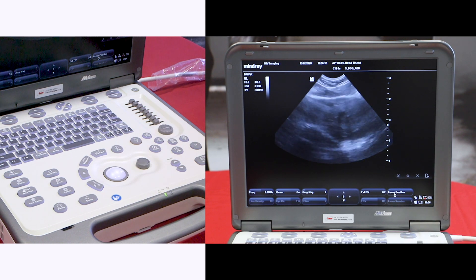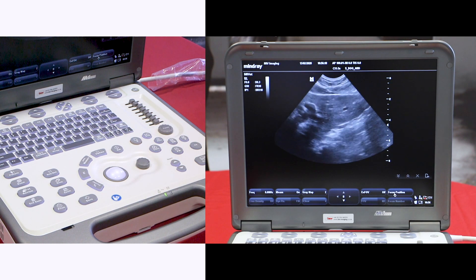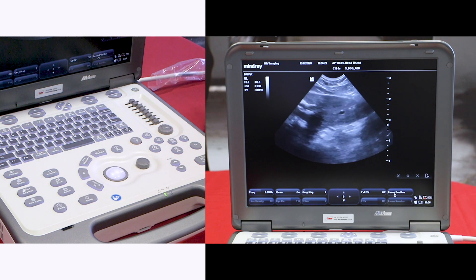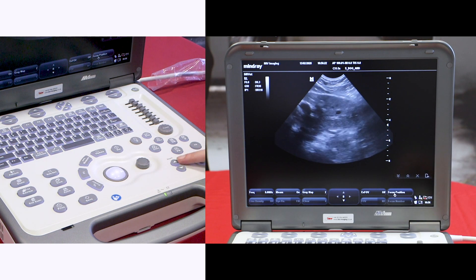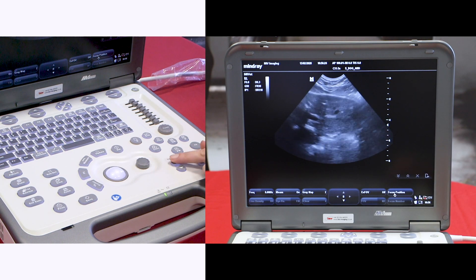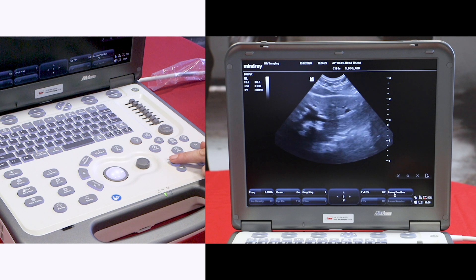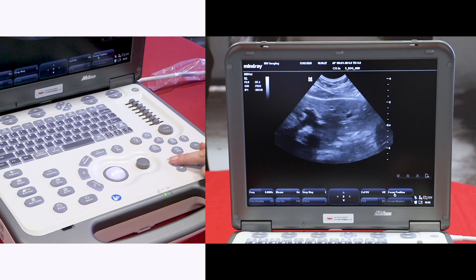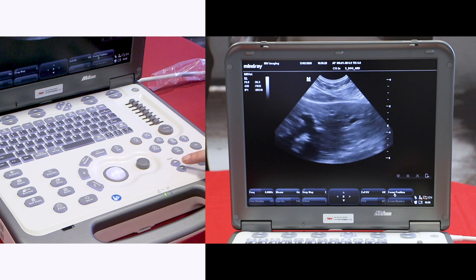The second thing I like to change is the depth. You have a centimeter scale at the side and the depth buttons are here. Try to make sure that the organ that you're interested in is taking up the majority of the screen.